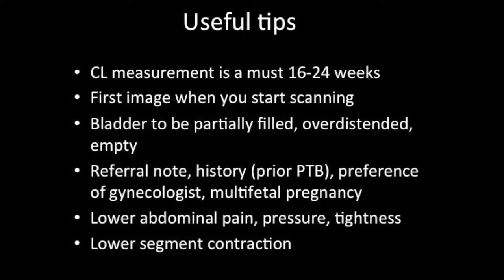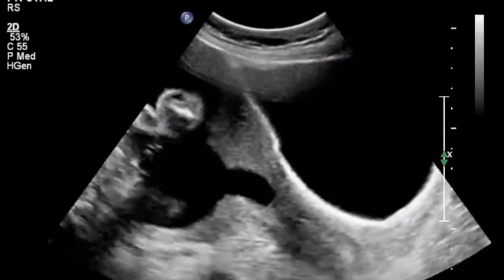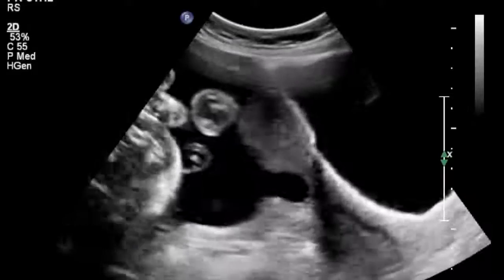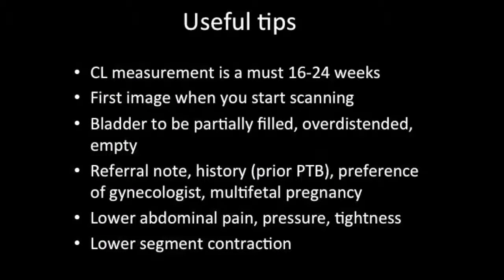But you should be aware of the lower segment contraction. You should not falsely label these as cervical incompetence. As you can see here, the closed cervical length is very good, and in fact what you are seeing here is not funneling. This is not the internal os. This is just a focal myometrial contraction on both the sides, and this should not be taken as cervical incompetence. And even if you feel that this is the internal os, you should look at the closed cervical length. The references say that if the closed cervical length is more than 3 centimeters, then even if the internal os is open, it does not really indicate a higher risk of preterm delivery.